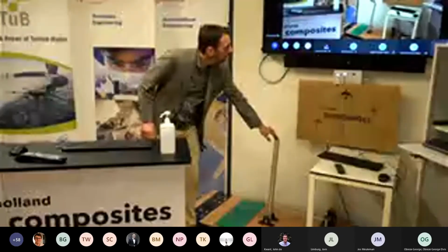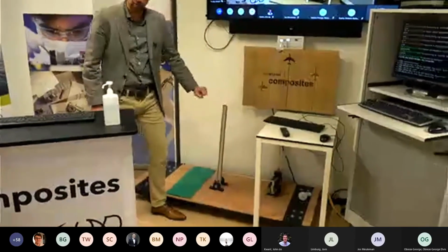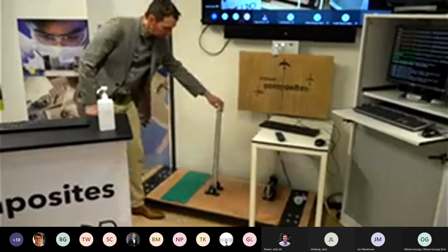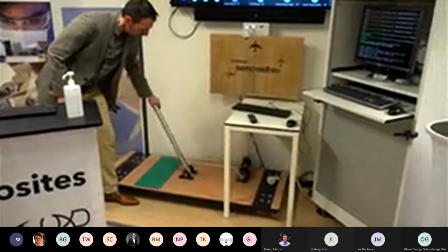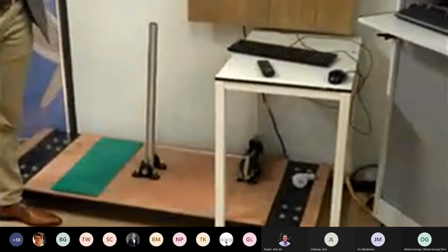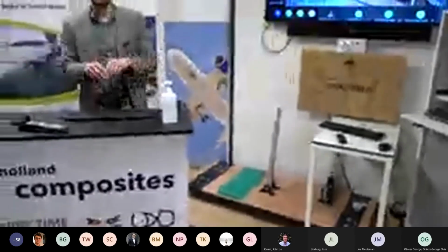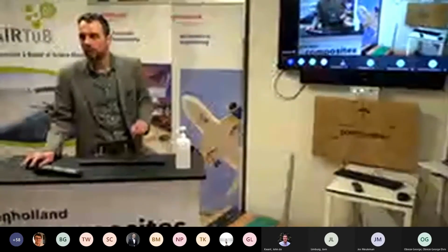Here below the table you see a control loading motor actuator with a force sensor and a gearbox, and it runs a model of a virtual spring. So if I let go, it goes back to the middle. There are virtual end stops there, and we can change parameters. This is where we came from when we started in 2006. We were pretty good at developing these systems for flight simulation, and now we wanted to apply that technique from control loading into a dental simulator.